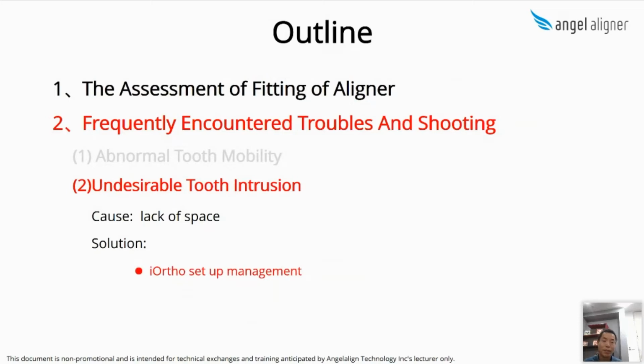In the IOS treatment plan stage, the doctor should ask the technician to make sure that there are open contacts, that means no collisions, mesial and distal to any rotated or lingually erupted teeth before moving the teeth, to create space first before moving it into alignment.